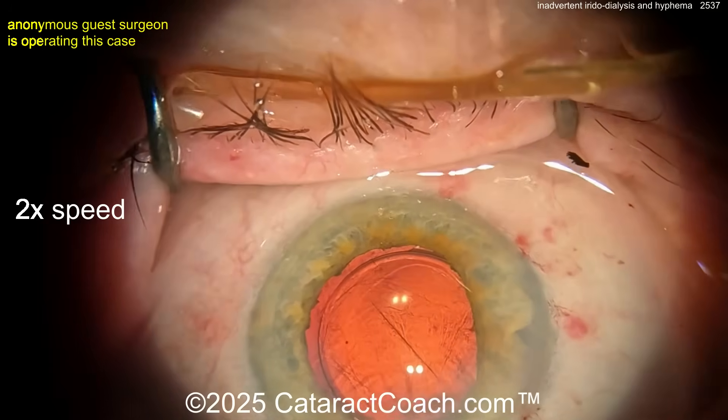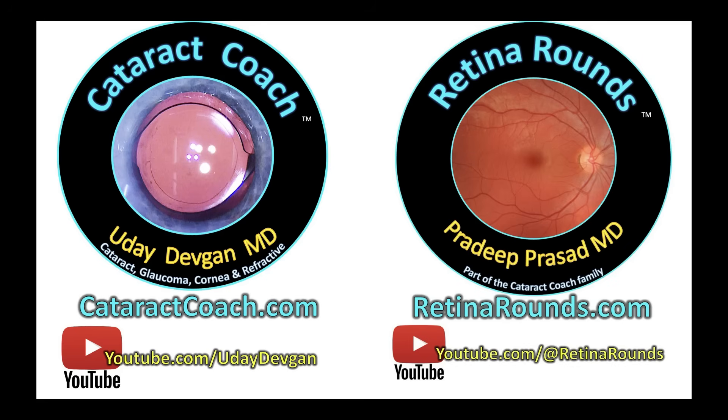Tough case — remember, it's not over until it's over.